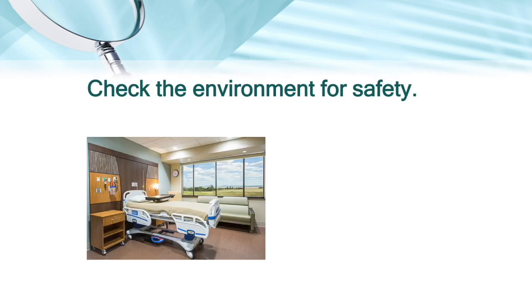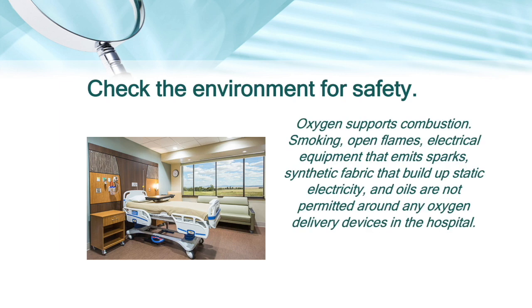Check the environment for safety. Oxygen supports combustion. Smoking, open flames, electrical equipment that emits sparks, synthetic fabric that builds up static electricity, and oils are not permitted around any oxygen delivery devices in the hospital.